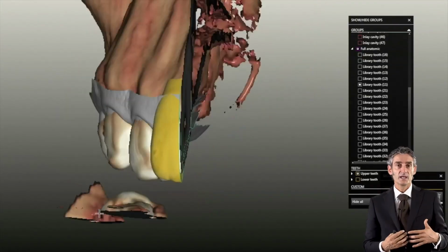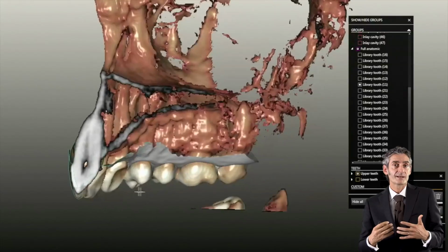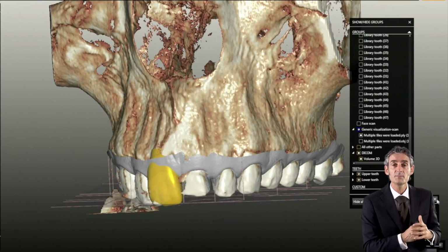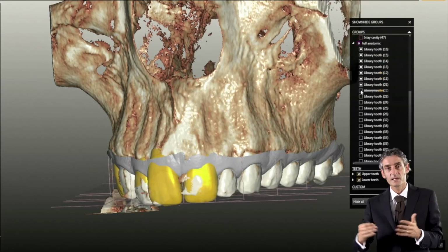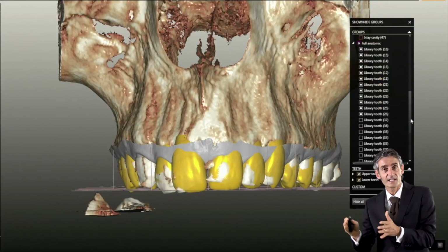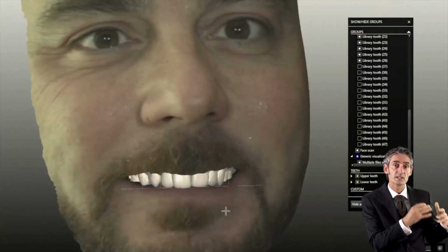Or, for example, if we are overlapping too much, and then we can create some kind of recession with our prosthesis, or where to place the implant according to the final position of the prosthesis. So every single step can be done in a really predictable way. So our way of thinking changed completely in this kind of approach. Everything can be evaluated before.